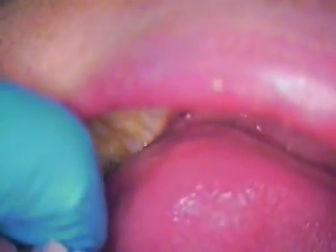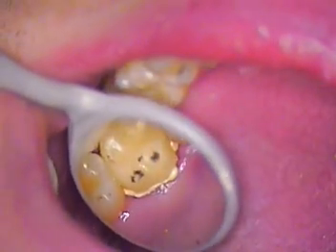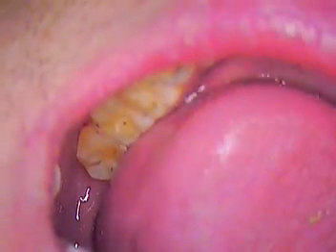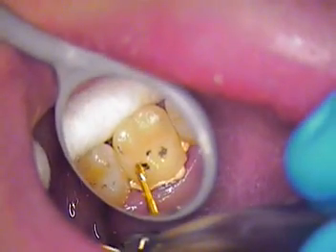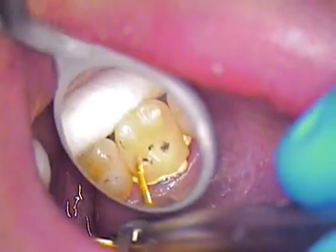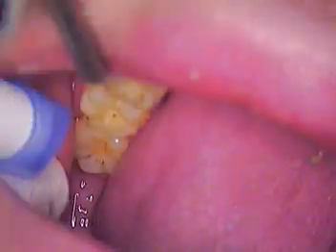Yeah. Let's check his bite, shall we? Open. Great. Close all the way. Tap, tap, tap. Grind a little bit. Open. Some high spots in there that we need to take care of. So we'll just do a quick adjustment. Now he's hitting here, here, here. So let's just lighten this up just a little bit right in here. Right in here, right in here. And right there. We'll do that again with the paper.